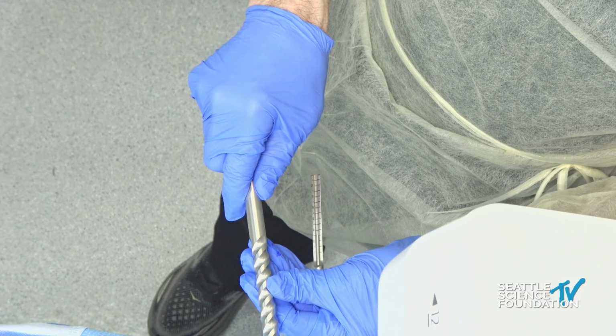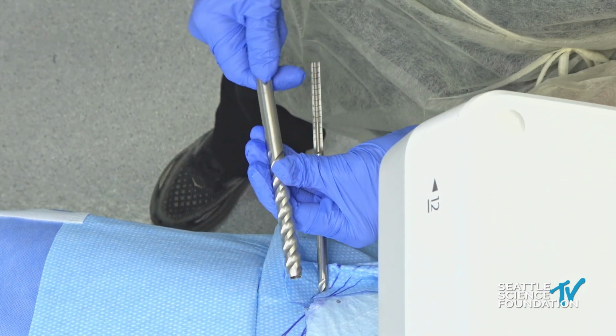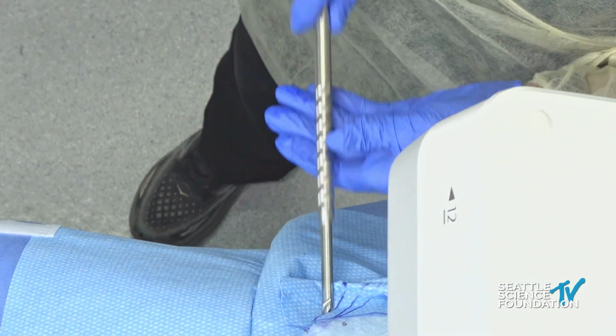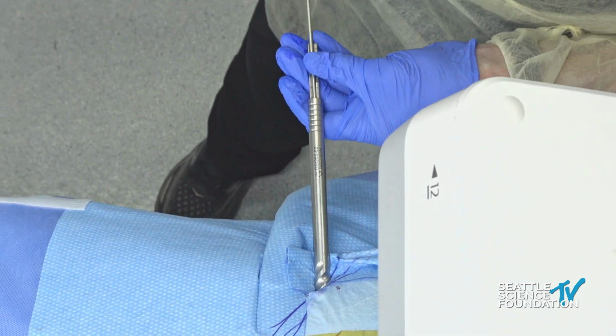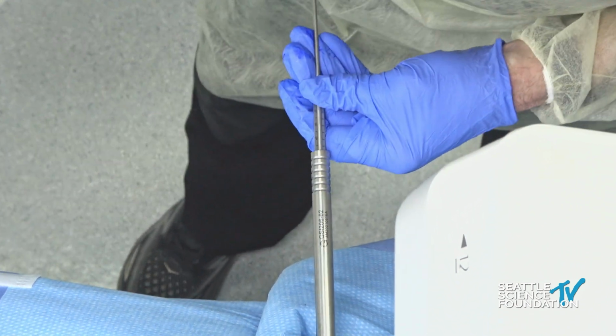This is dilator 2. These have soft tissue threads. This is designed to be turned in like this through the soft tissue, these large threads. So it's a righty-tighty in through the soft tissue using a clockwise turn. And then I'm going to place the extender pin, and this is a reverse thread. So if we use power, it doesn't unthread it.